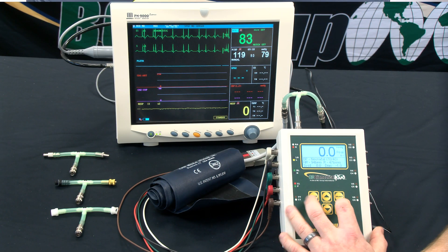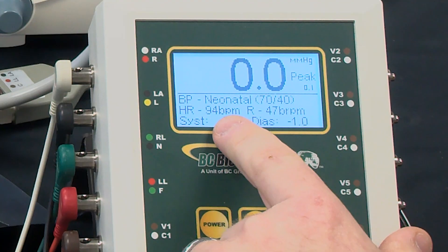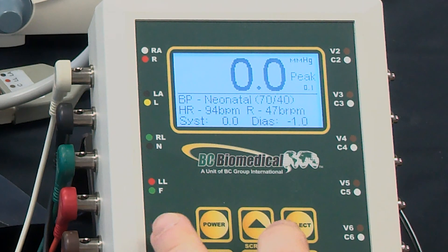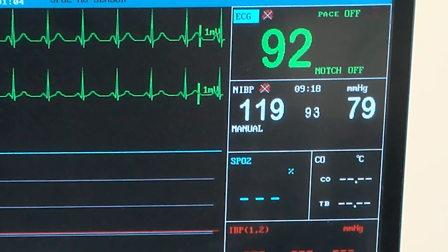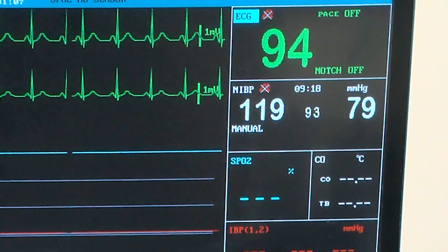We can scroll through all of the available settings. In this case the heart rate changed and we can see that heart rate being measured by the monitor.